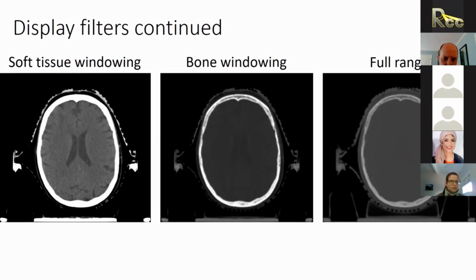When we started, we didn't have a cone beam CT. We just had orthogonal portal images. And we used to have a gap, but with feathering, as we change the gap area every week in order not to have cold spots or hot spots, as you said. We do the feathering technique all through the radiation course. Every week we had a different shift. So I will share this paper with all the groups. It's very useful and answers many questions for craniospinal radiation.